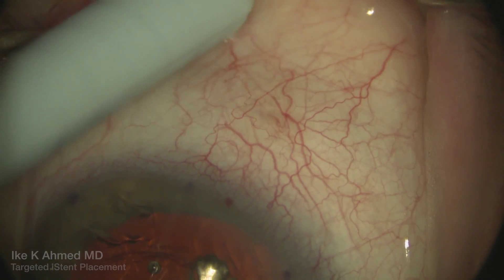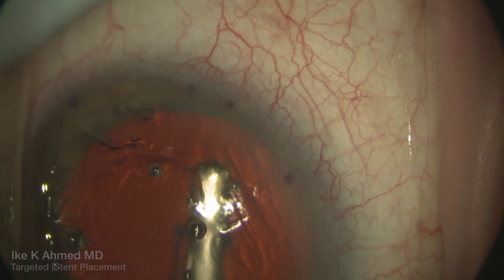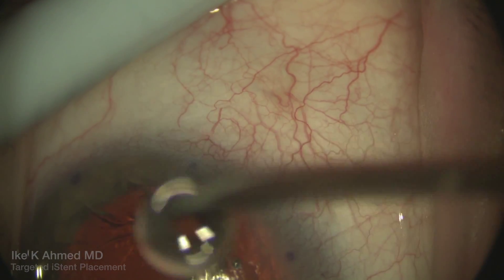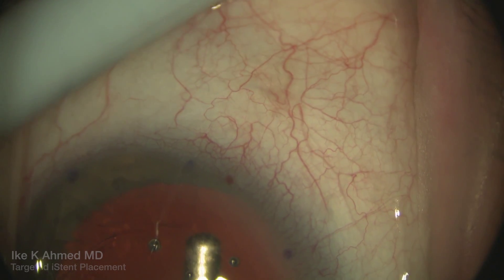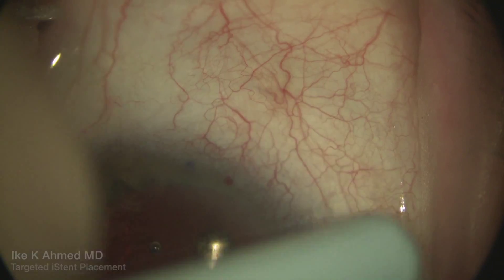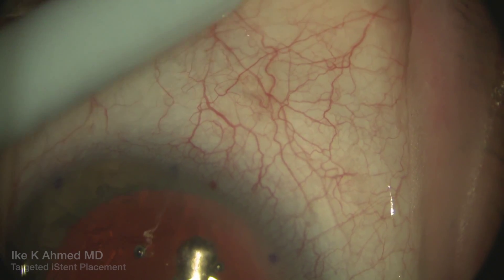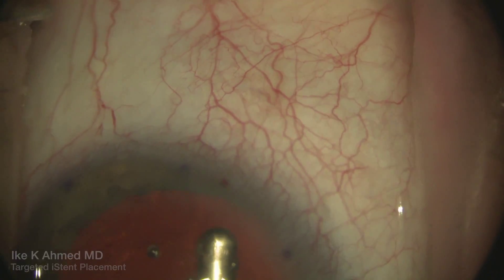The preferential targeted placement of these iStents will hopefully guide aqueous directly through the system. As sealing pressure is increased, we see significant blanching of all of these vessels — aqueous veins, episcleral veins, and conjunctival veins.